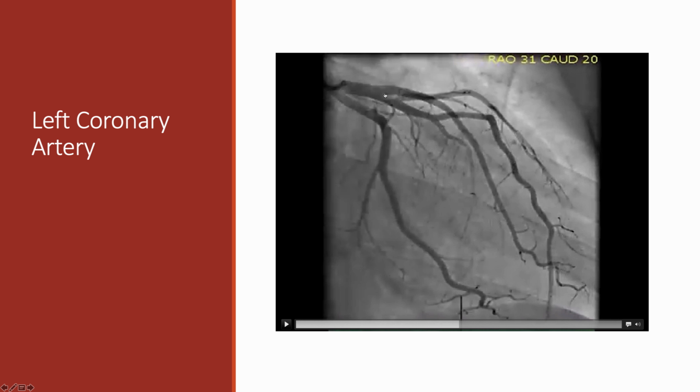Usually there's a part of the coronary artery where there's about a length this long of the left main coronary artery, and then the circumflex comes off of there. But in this case, they both come off right at the aorta. And so here we have the circumflex artery that goes around the back of the heart, and here we have the LAD that goes down to the tip of the heart.